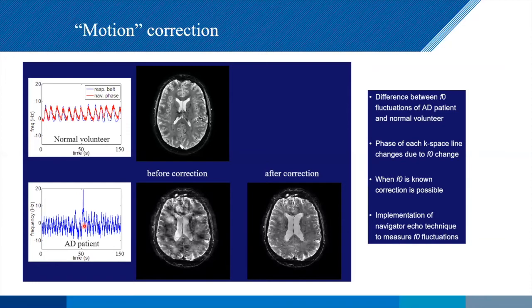And that means that you get changes in the brain, and this effect is supralinear with magnetic field. This you're really not going to see at 3T. So literally, if somebody is moving their arm up and down, it will produce a measurable frequency change in the resonance in the brain, which of course suggests that actually this is quite easy to fix, right? Because we can simply do some navigator echoes, and we can look at what's the phase of each k-space line relative to baseline, and we can just phase shift it.